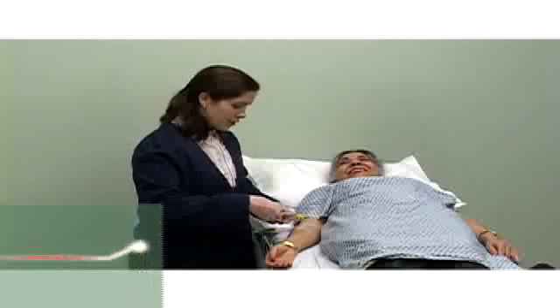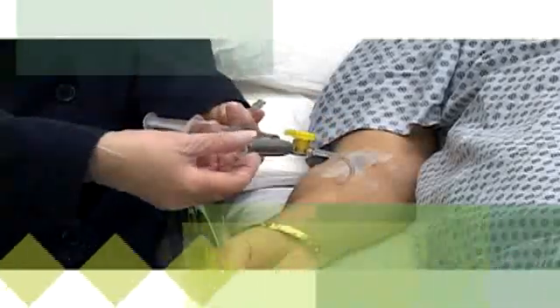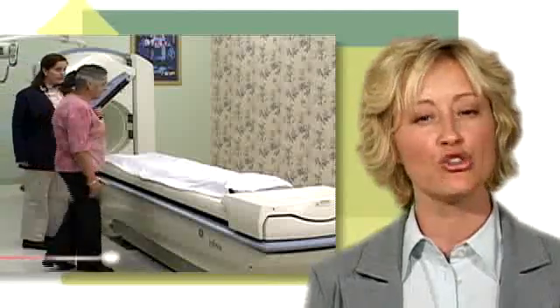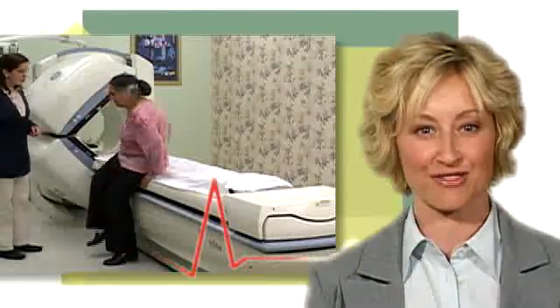A second dose of Cardiolite will be injected through the intravenous approximately four minutes after the Persantine infusion. The intravenous will be removed when the Persantine stress test is completed. You can leave the clinic after the Persantine test, but must return two to four hours later for a second set of pictures. The technologist will assign the return time.